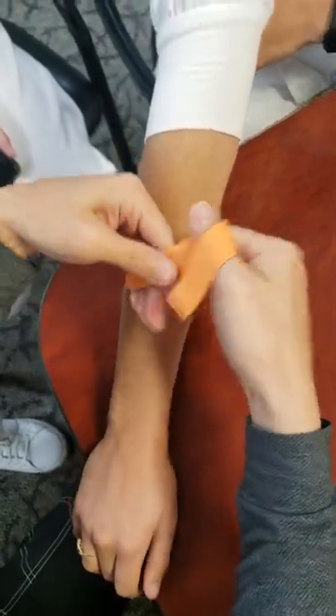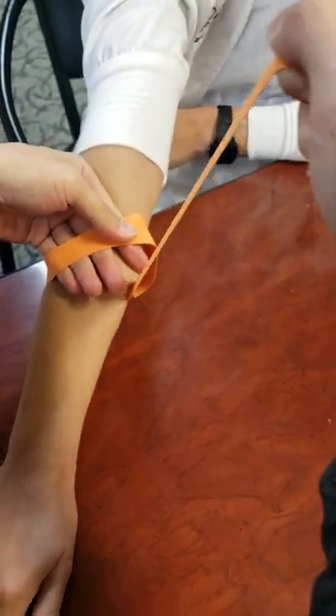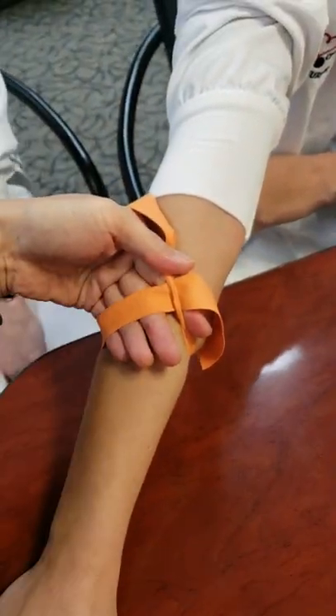My way is to hold this with the forehand fingers — with the thumb and the index — taking this and pulling it up really tight and giving it to the finger. So I'm holding with this finger now, okay, with thumb and index.